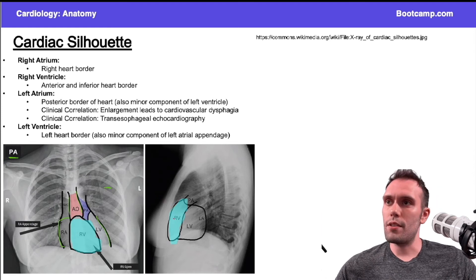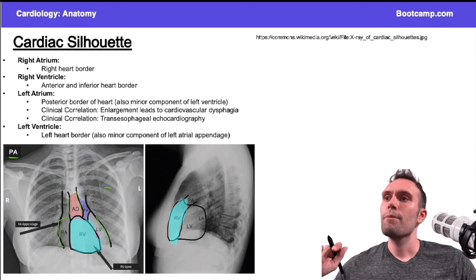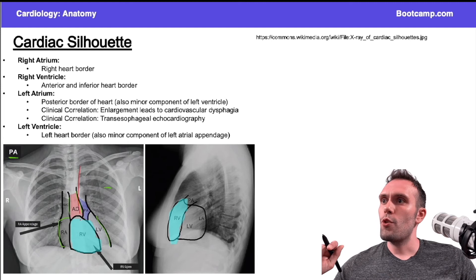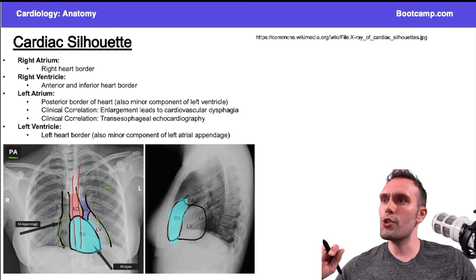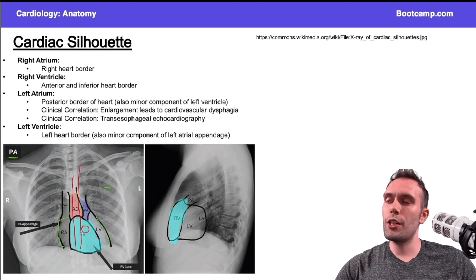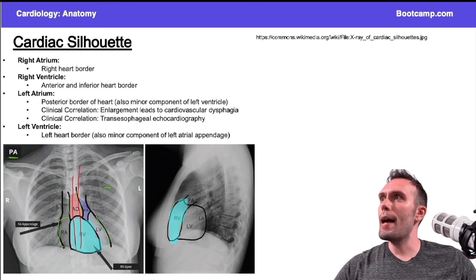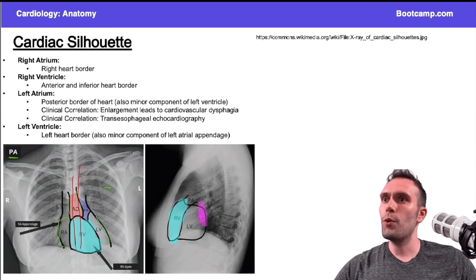There is an exception, which I'll talk about in the next slide. Obviously the lungs can commonly be affected too, but if the sternum is running in the middle and I go parasternally, I'm very likely to affect the right ventricle — particularly in the third and fourth intercostal space.